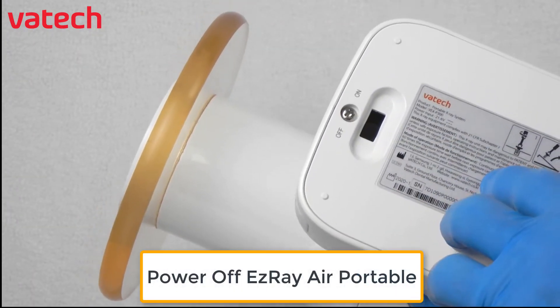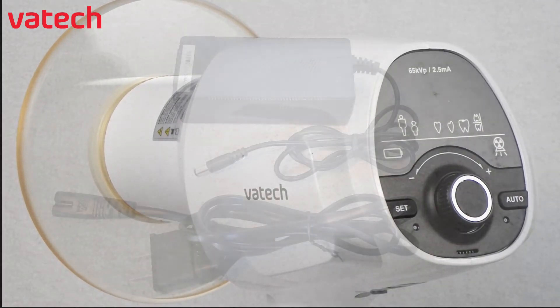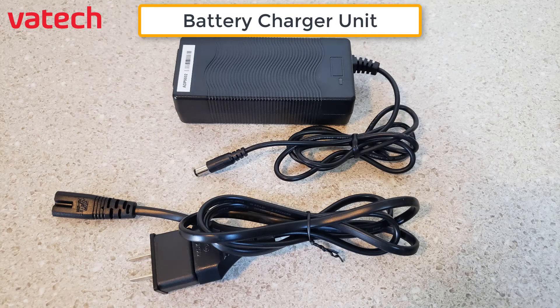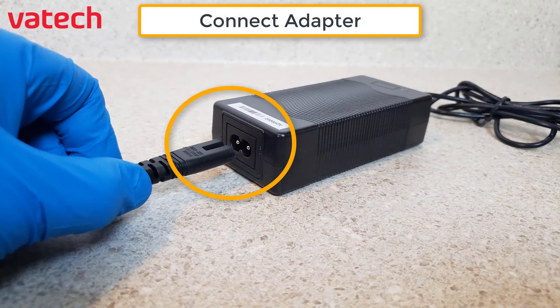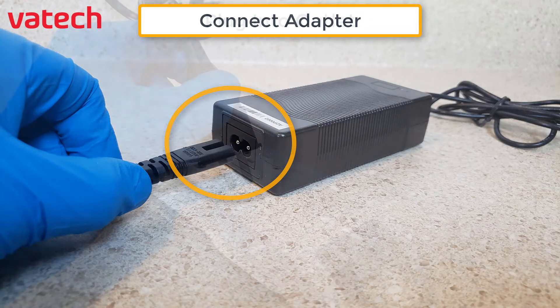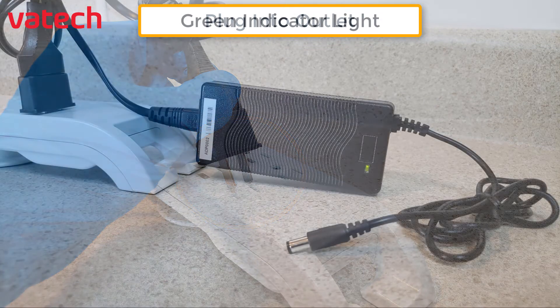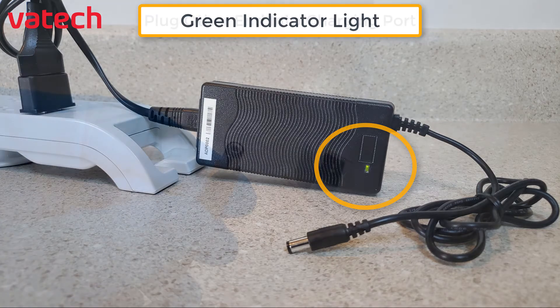Move it back from an on to off position and begin plugging in the AC adapter. The AC adapter comes in two parts — simply connect the two parts together. Plug one end into an AC outlet. A green indicator light will verify that it is plugged in properly.